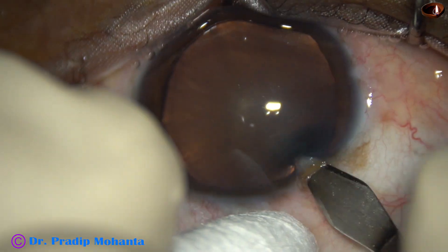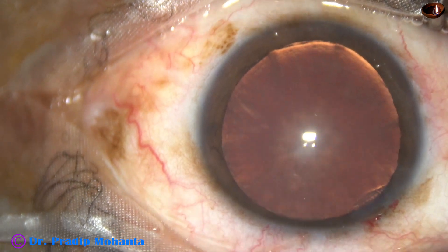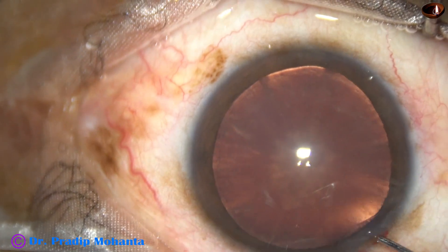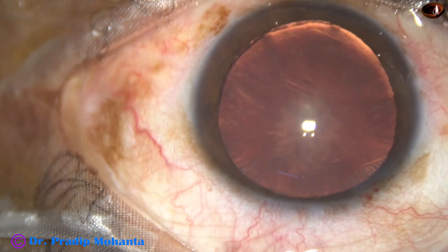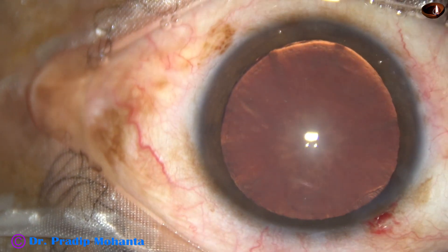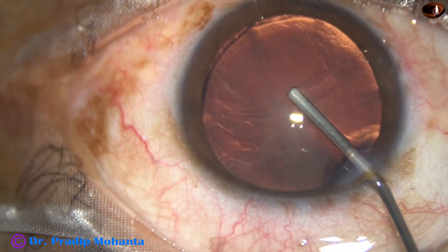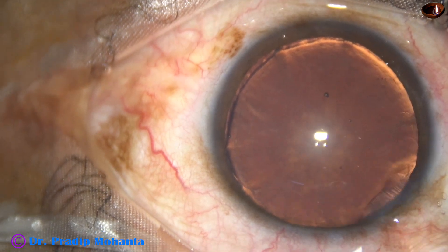Let us see how we can manage this case. This is the main incision on the posterior aspect of the limbus with a 2.8 millimeter steel keratome. This is phenocaine, which contains xylocaine, tropicamide, and phenylephrine. And this is visco, 2% hydroxypropyl methyl cellulose.